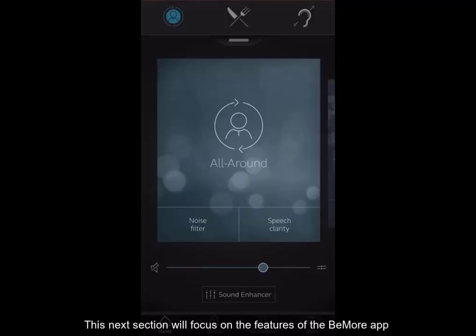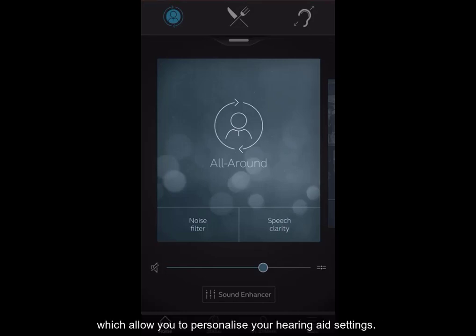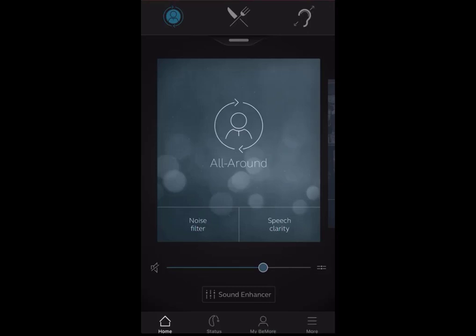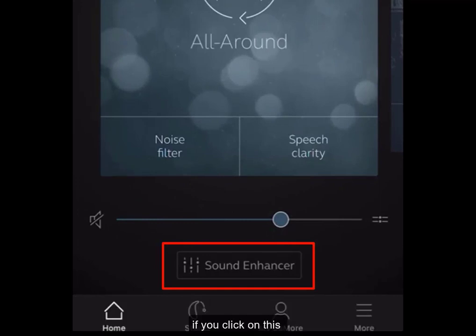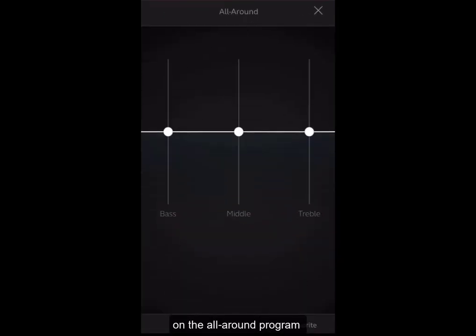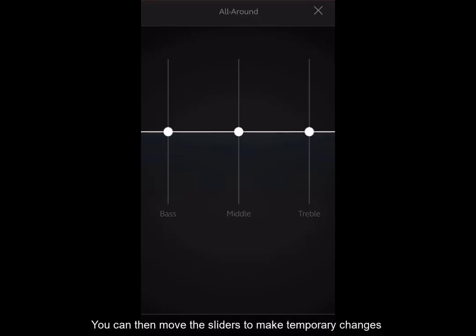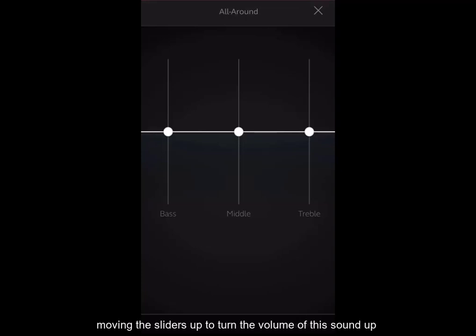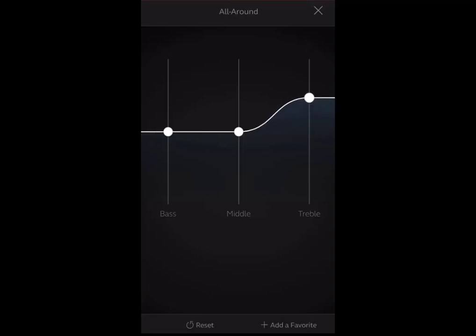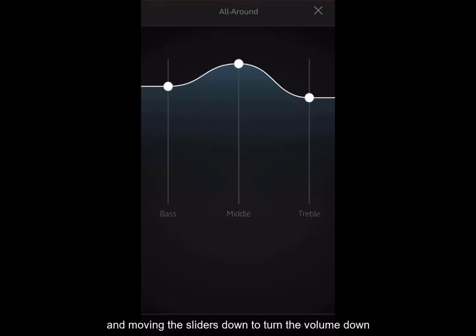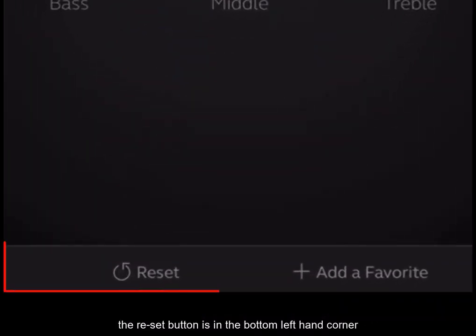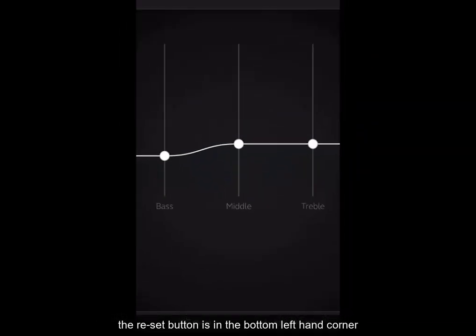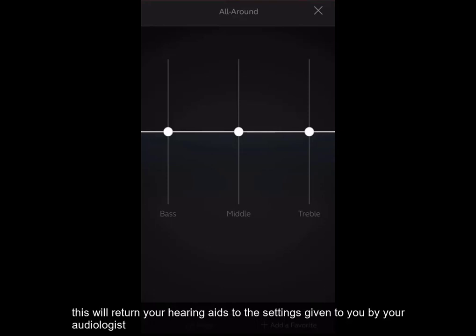The next section of this video will focus on the features of the Be More app which allow you to personalise your hearing aid settings. On each program, you will see a sound enhancer button towards the bottom of the screen. If you click on this on the All Around program, you will see a bass, middle, treble graph. You can then move the sliders to make temporary changes to the bass, middle or treble — moving the sliders up to turn the volume of this sound up, and moving the sliders down to turn the volume of this sound down. If you make a change which you do not like, the reset button is in the bottom left hand corner. This will return your hearing aids to the settings given to you by your audiologist.